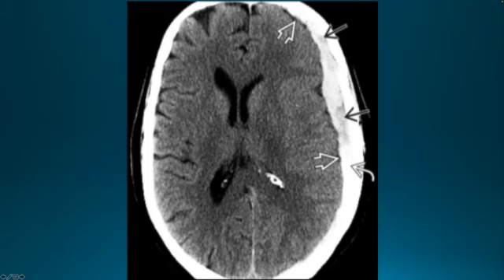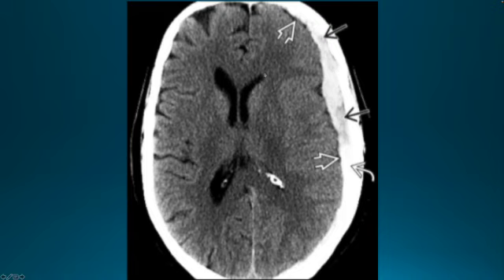So what are the signs of mass effect? Well, sulcal effacement. Here on the right side, you can see all the normal sulci within the brain. In the left hemisphere, we don't have any of those — they're all effaced. We also have partial ventricular compression. You can see that the frontal horn and the atrium of the left lateral ventricle are smaller than their right-sided counterparts, related to the compression and the mass effect.